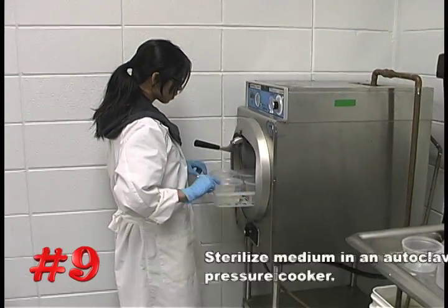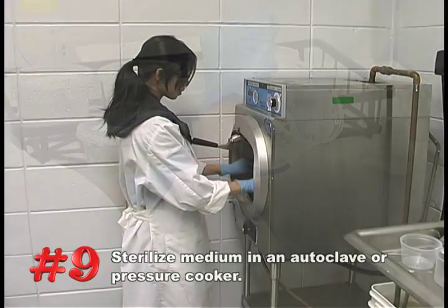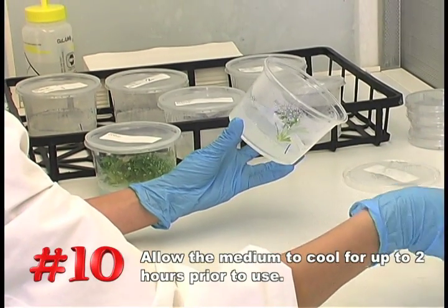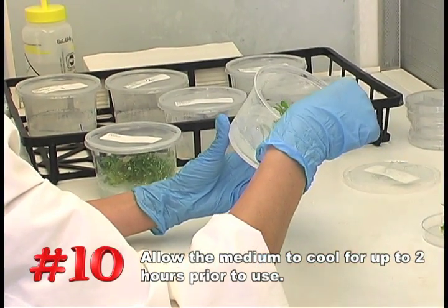Number nine, sterilize the medium in an autoclave or pressure cooker. Number ten, allow the medium to cool for up to two hours or until the gelling agent is completely solidified prior to use.